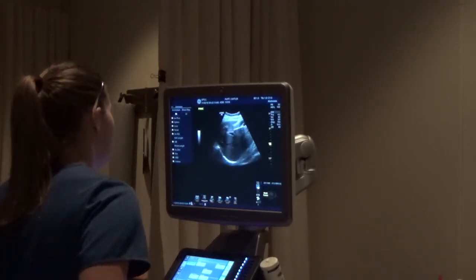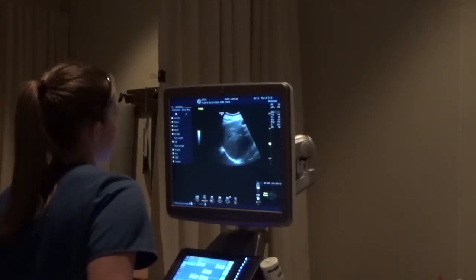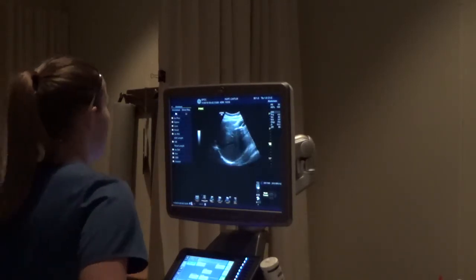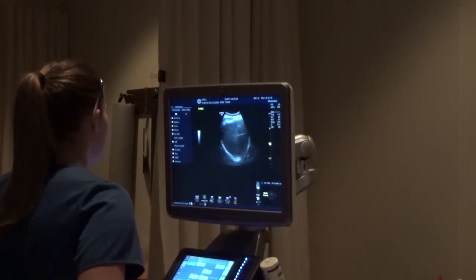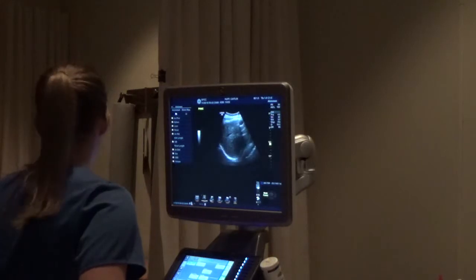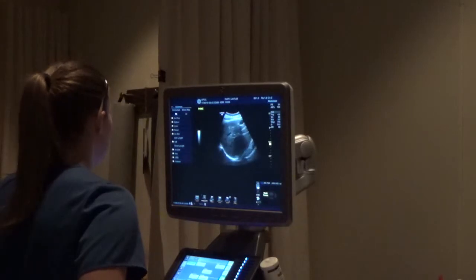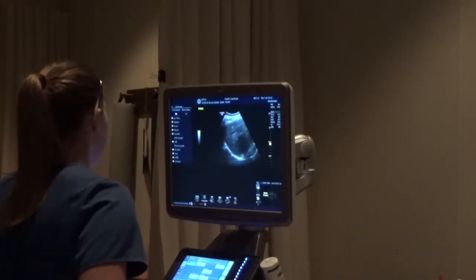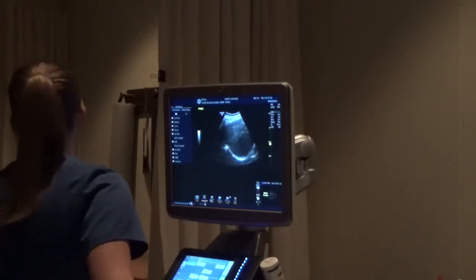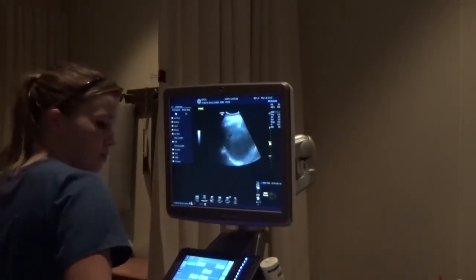Okay. And when you have portal hypertension, what else are you going to see? Initially the main portal vein will be enlarged, and then there will be cavernous transformation around the hilum of the liver. And you could also see some hepatofugal flow. Okay, so cavernous transformation is what? Those are just collateral vessels that go around the main portal vein to bring blood flow. Okay, because of what? Because it starts to thrombose. Right, that's okay. All right, we're going to switch to the gallbladder.